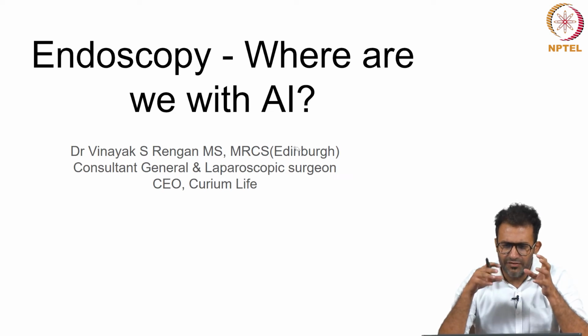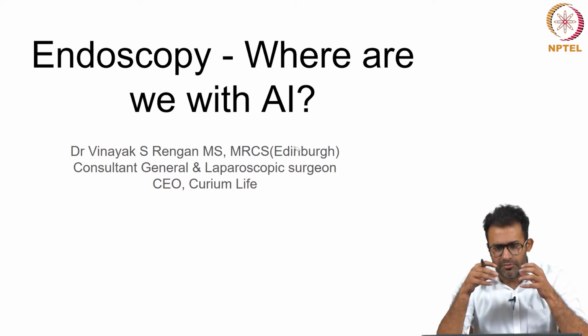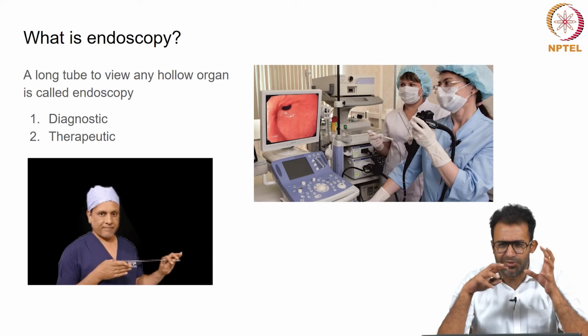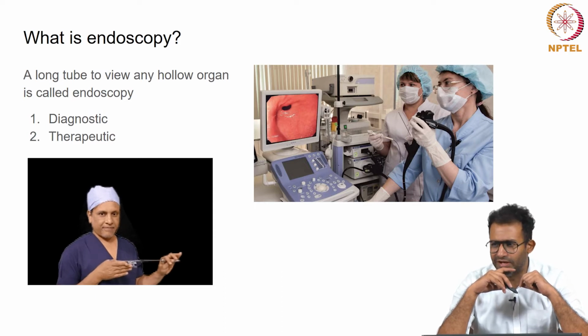And we're going to understand where this field stands with regards to image processing, machine learning, deep learning, and everything. So endoscopy is a very misunderstood term. There has been a lot of hype, a lot of misconceptions regarding endoscopy. People imagine a scary looking surgeon with sharp instruments poking holes into wherever sharp stuff is not supposed to go, but it's not as scary. It's one of the most commonly done procedures all over the world.